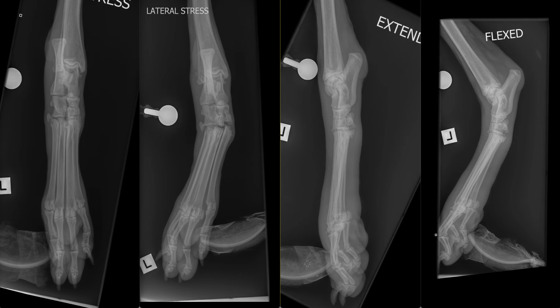When a stressed view is applied to the dorsal aspect to evaluate if there is increased laxity in extension, we observe that there is no change in the dorsal aspect or widening of the joint spaces of the tarsus.